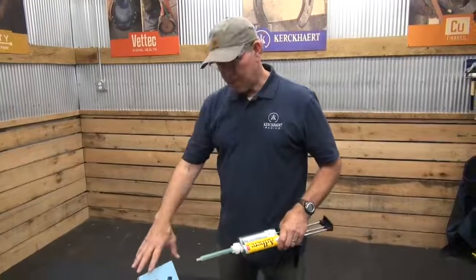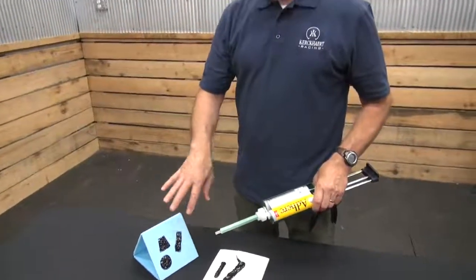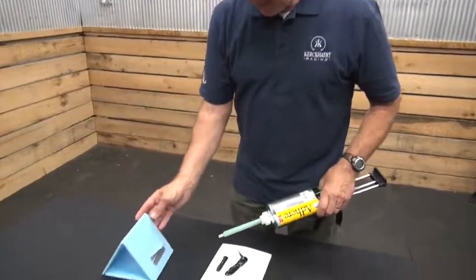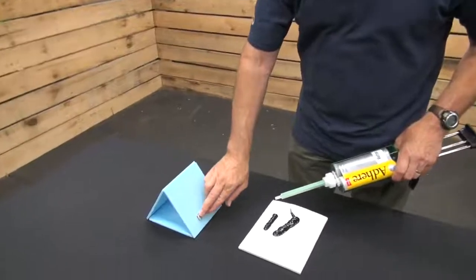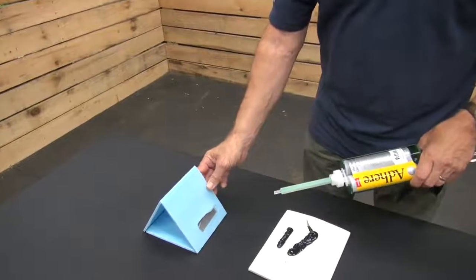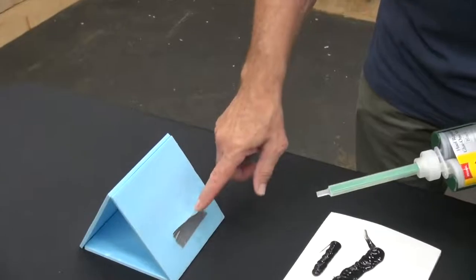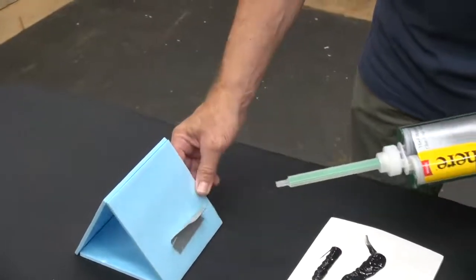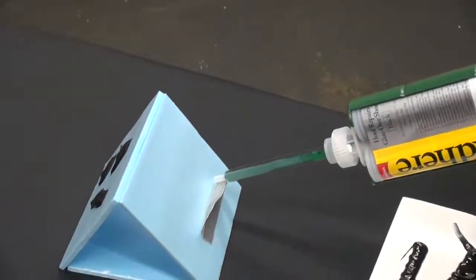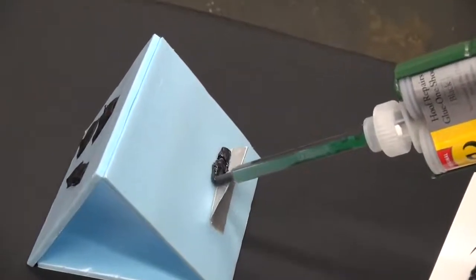All right, so you can see that with a little practice, a little technique, we can actually put the material exactly where we want it. There is another way to do this, and this sometimes works better in the summer when materials are a little more fluid. If you want to keep material from slumping down to the ground, you can actually just put a piece of duct tape at the bottom of the defect and use that as your dam, so to speak. So we can, and this requires a little less control.